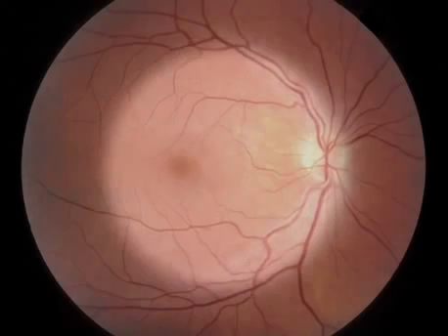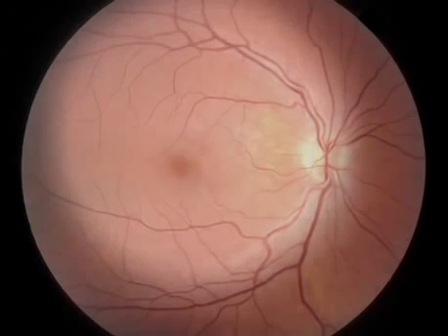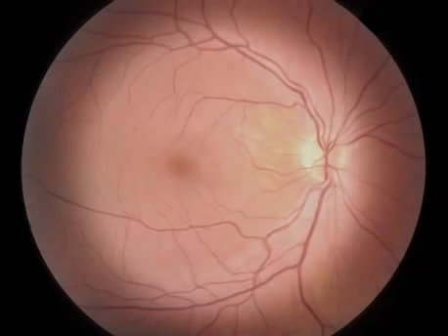Finally, the diffuser aperture. This is helpful when you're first learning to use the indirect. It provides a broader illumination beam and allows for more movement of the patient or the condensing lens in the viewing axis without losing the fundal view.